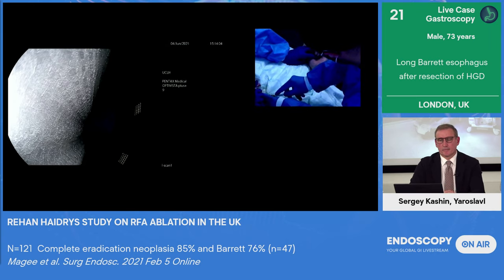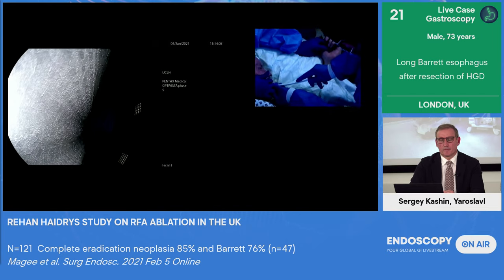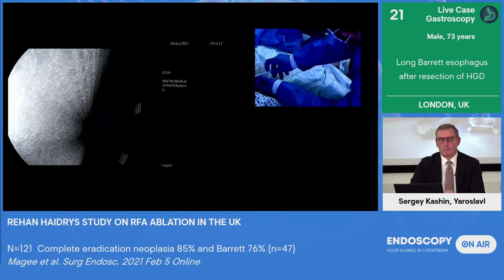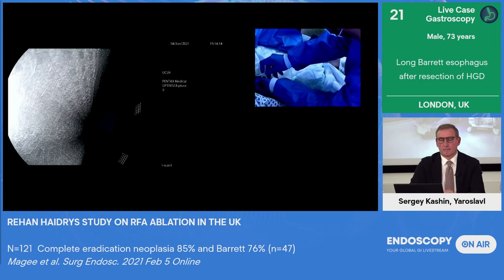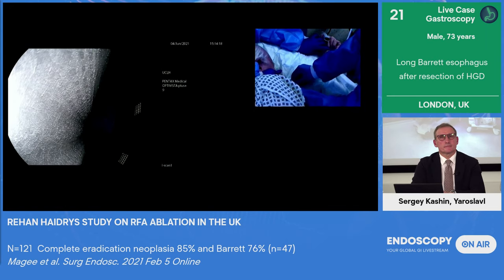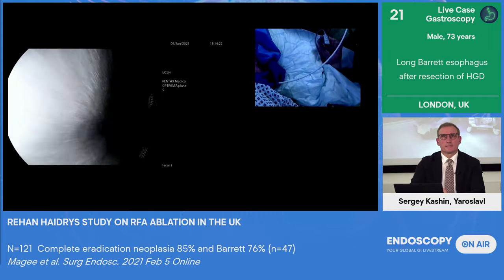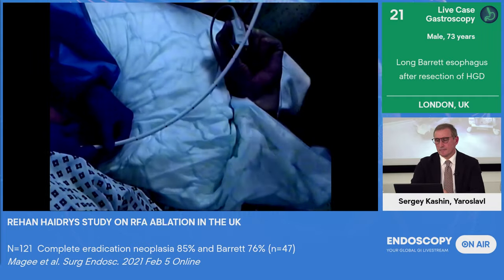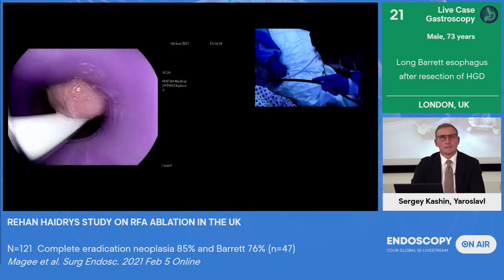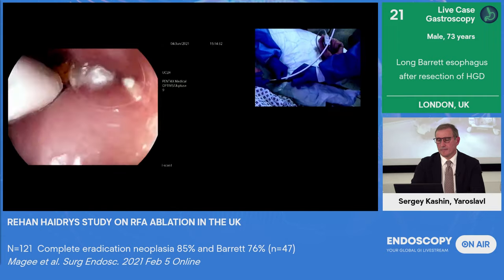So we'll go over a wire, with plenty of sedation here because it can be a little bit uncomfortable. I'm just going to go down there now. There we go. Okay. So once that's down, very nice. We'll get the endoscope down side by side. Can someone please hold the endoscope there for me? Hold that there, please. That's it. Okay. So we'll go back with the endoscope now. Before I put the wire down, it's important to say that I cleaned the Barrett's with a mucolytic agent.